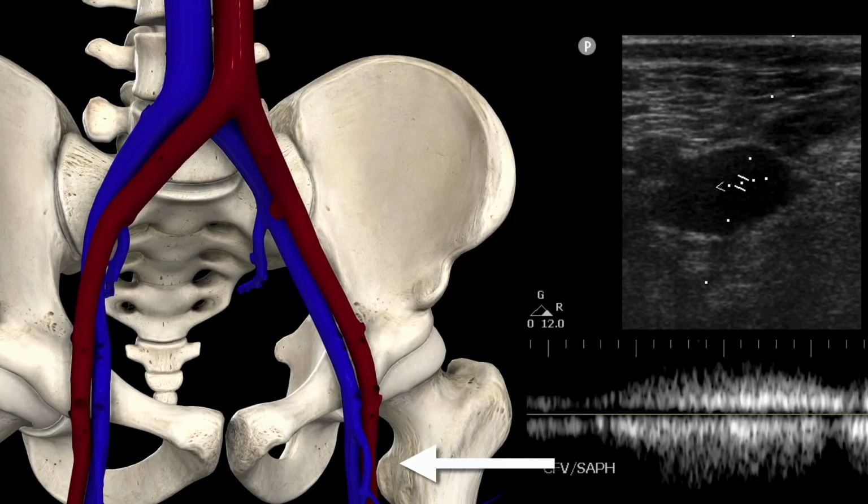In this image, we put pulse wave Doppler in this blood vessel, and we had the patient breathe. This is just normal breathing, not a deep breath with a super high negative intrathoracic pressure. You can see some undulation in the venous waveform of the blood flowing through that vein. If you have zero obstruction, you're going to have a transmission of those venous pressure changes from the IVC down to where you're evaluating it with the probe.